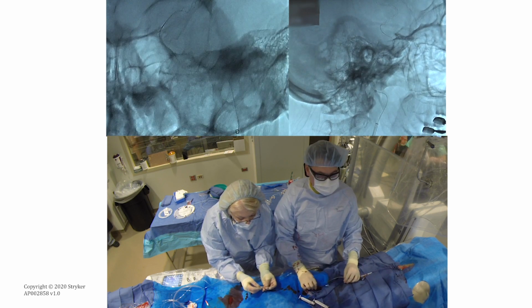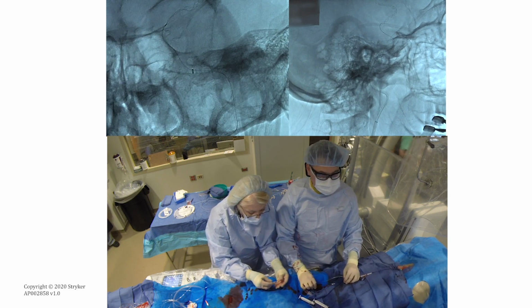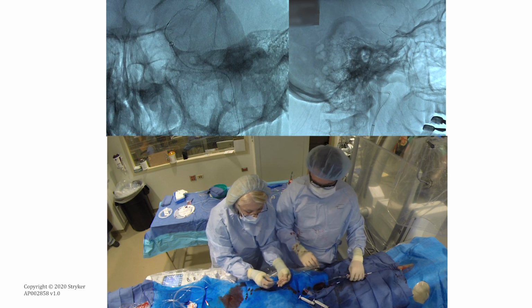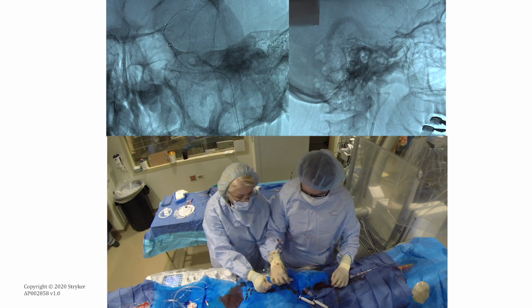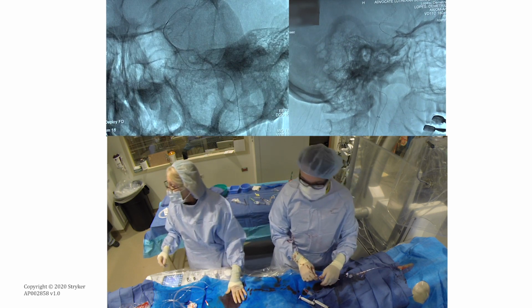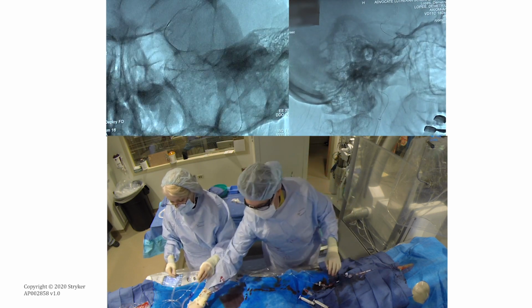The aspiration catheter in this case is a Cat 7, and we are in position navigating to trap now the clot between the stent retriever.